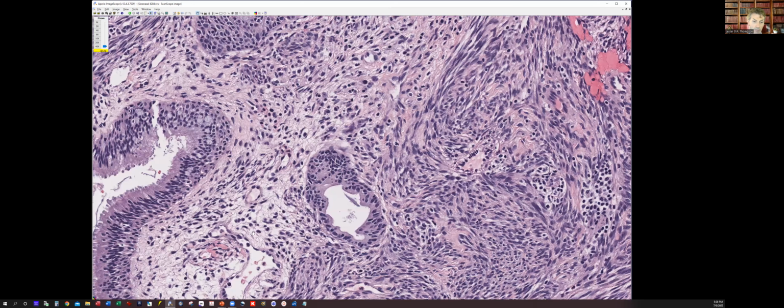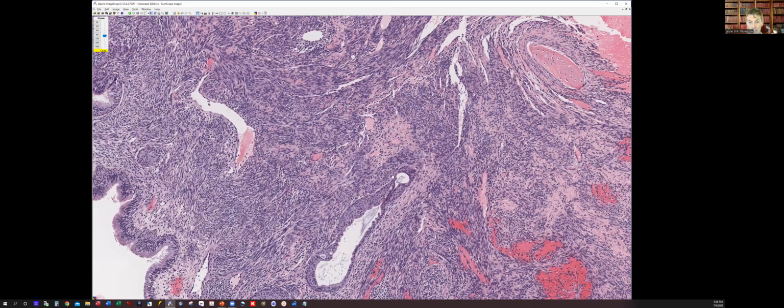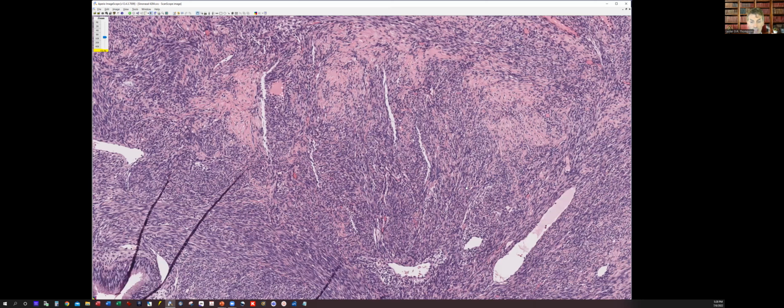And in fact, as you look at the epithelium, it seems to be pulled down and then expands down into this region. And so the question at this point is, are these areas of epithelial islands deep within the tumor actually part of the tumor, or is it just a captured phenomenon and perhaps it is separate? So this is always a consideration when you look at these neoplasms to try and come up with what you may feel to be the correct diagnosis in this example.